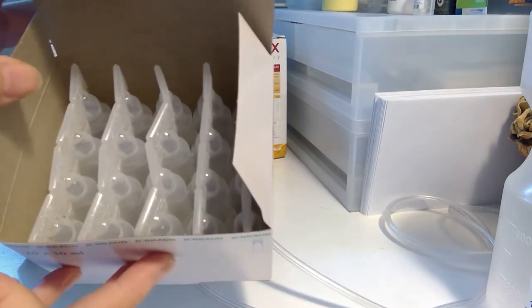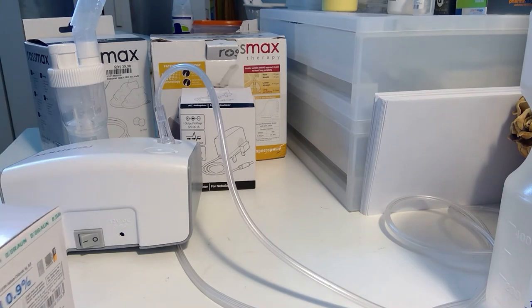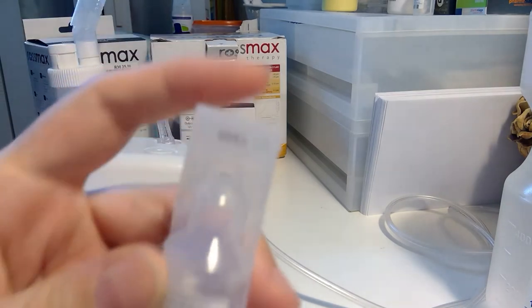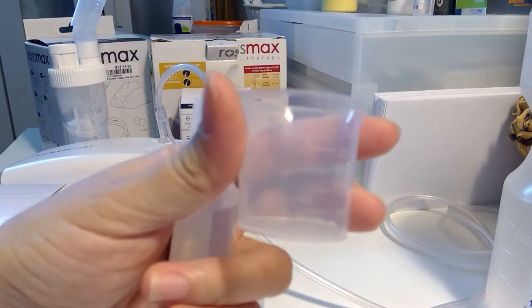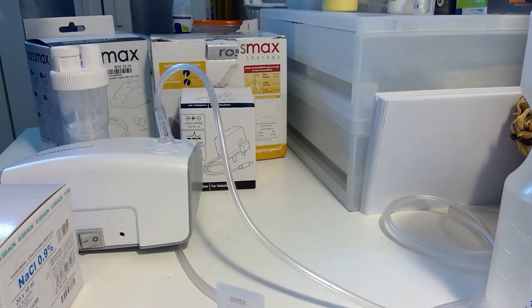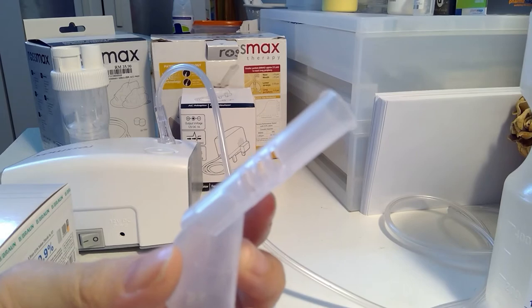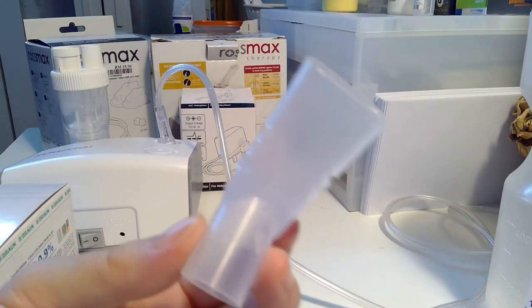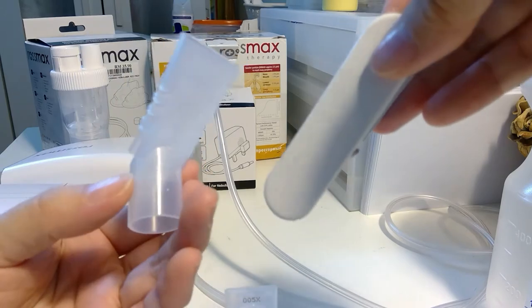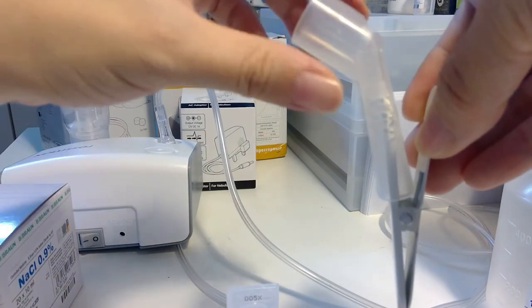It can last quite long and you can be sure it's really hygienic. After I open up a pack, I have this small container where I just store it. Whenever I need to wash the mouthpiece — which is quite important to wash — especially if you're using it between two cats, you need to make sure there's no cross-contamination if one cat coughs or sneezes on it. I have this little peg hook, and when I'm done and wash it, I just hang it on the wall.